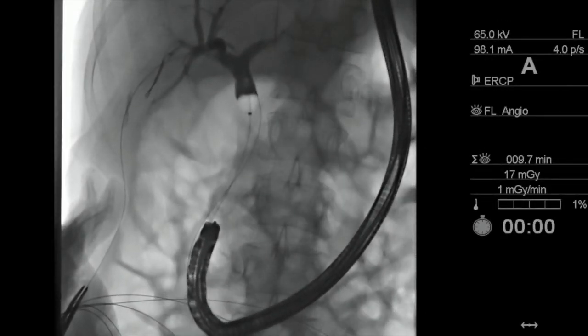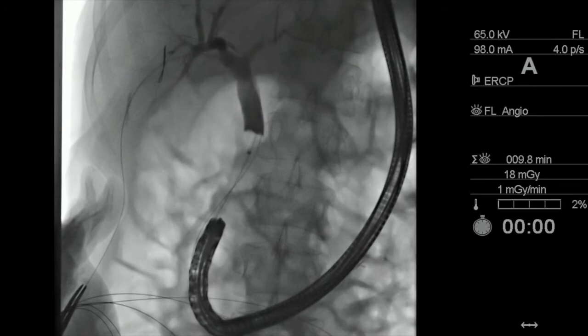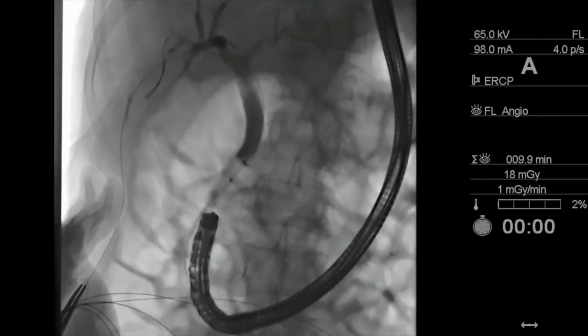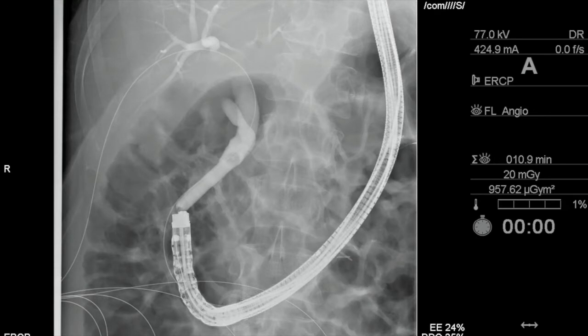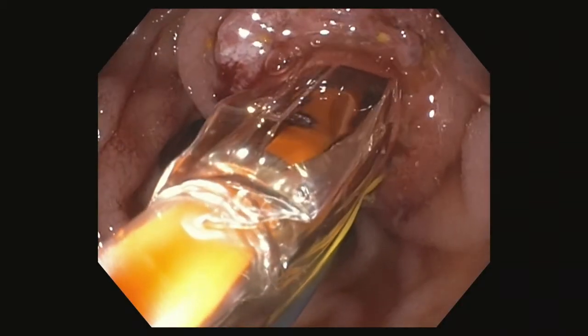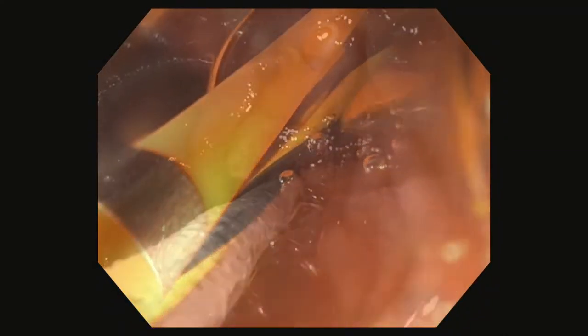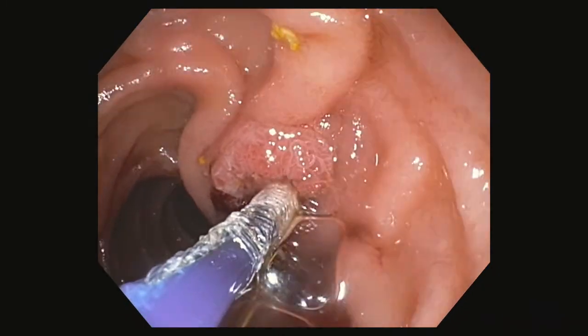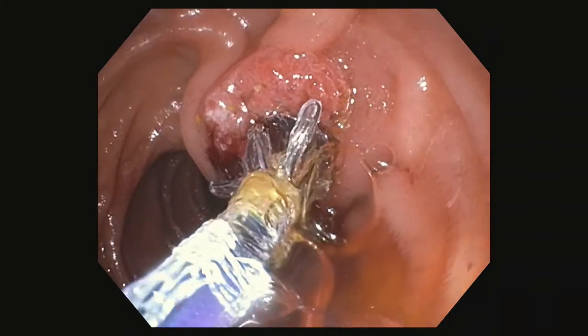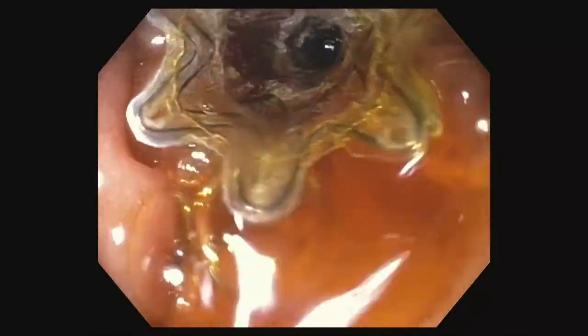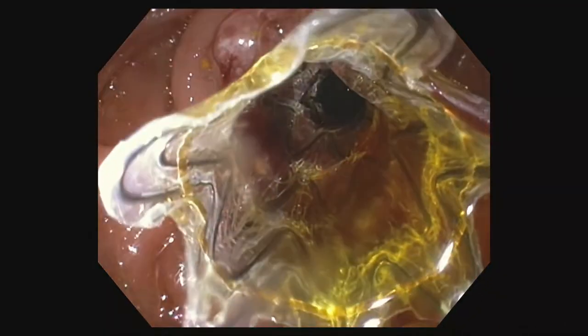Following biliary cannulation, balloon sweep with an 8.5-millimeter balloon revealed sludge but no evidence of stones or strictures. The 11-millimeter extraction balloon could not traverse the papilla, so balloon sphincteroplasty was performed with a 9-millimeter biliary balloon dilator. The safety guidewire was then removed and a 10-millimeter by 4-centimeter fully covered self-expandable metal stent was placed into the common bile duct. Contrast and bile drained readily.